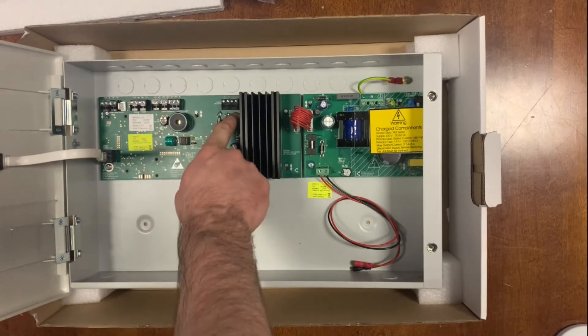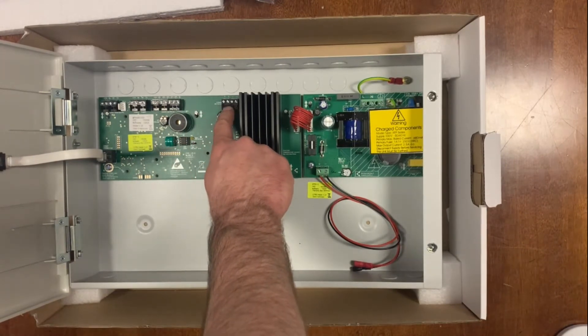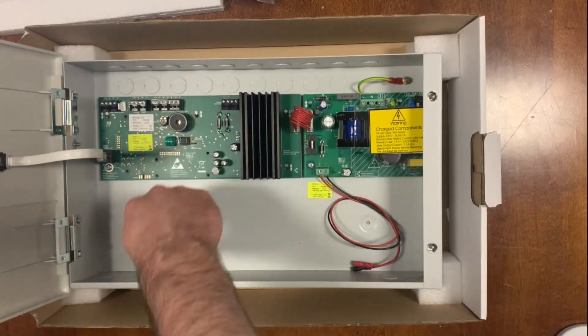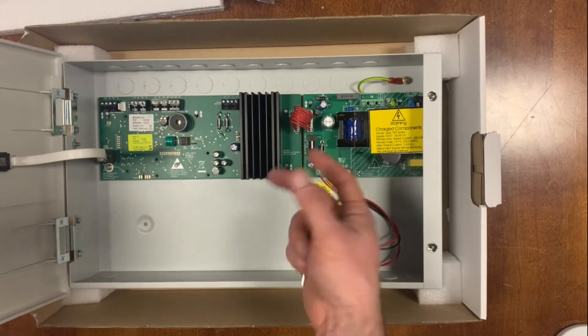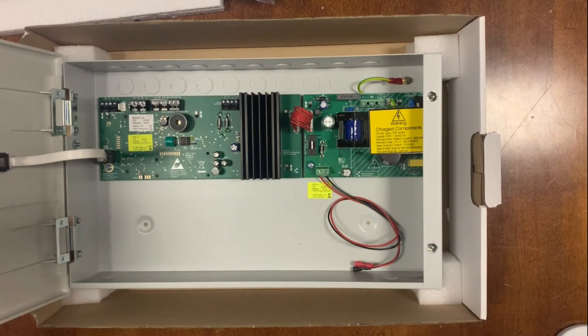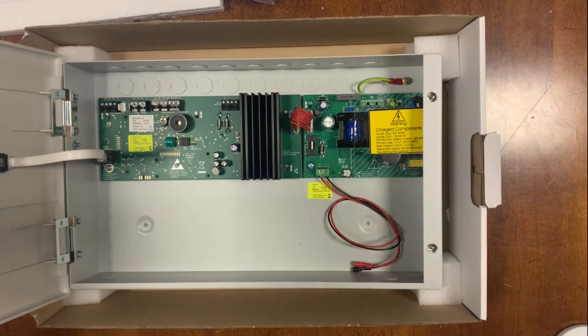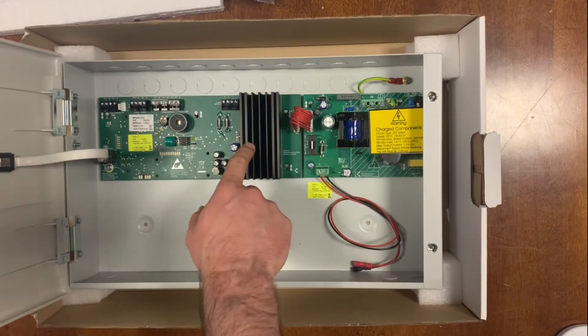In here you have the network comms. Fundamental to this system — you come out of this controller into a network splitter using something like twin and earth 2-by-1 cable, something with a fairly decent thickness for transmitting the signal out to the network splitter. From the network splitter you go off to your various field devices — separate videos on all of those.